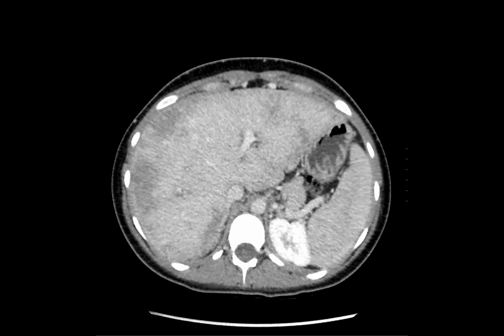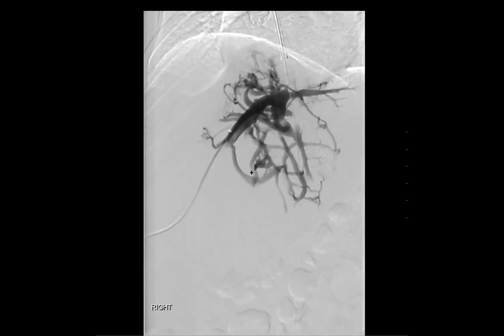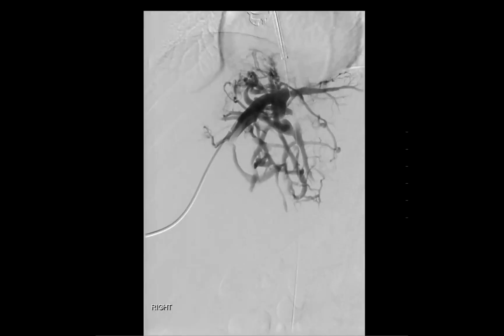So this patient has a history of a blood disorder of some sort and started developing clots when she was young, and developed Budd Chiari. That patient's now on the transplant list for this condition, and we got a pre-transplant. And let me, I can show you. Can you show the hepatic veins when you go back to the CT? Oh yeah, let me go back to the hepatic veins.